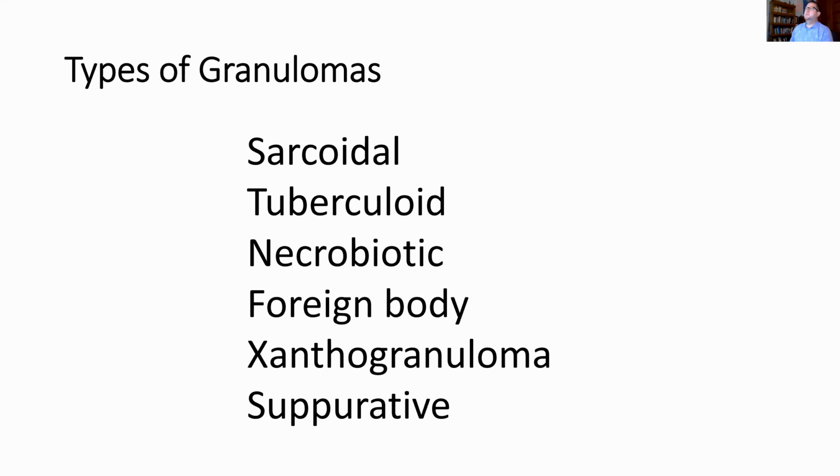So types of granulomatous dermatitis, these are the ones that serve us, and we'll talk about the sarcoidal pattern. A sarcoidal pattern doesn't necessarily mean it's sarcoidosis, and we'll get into that.